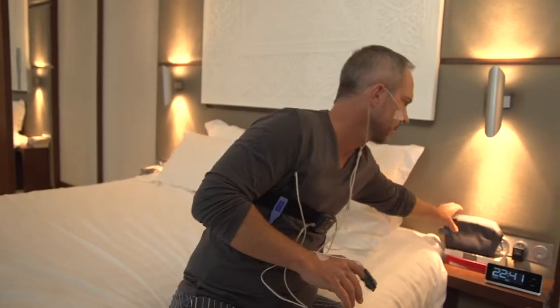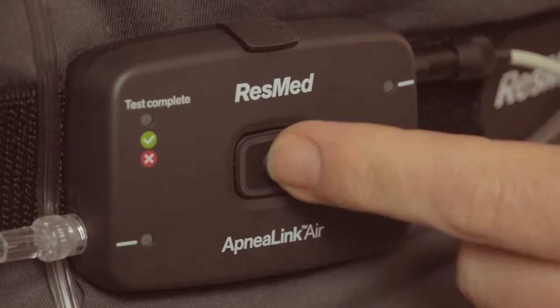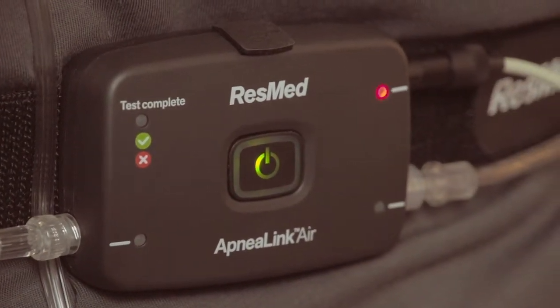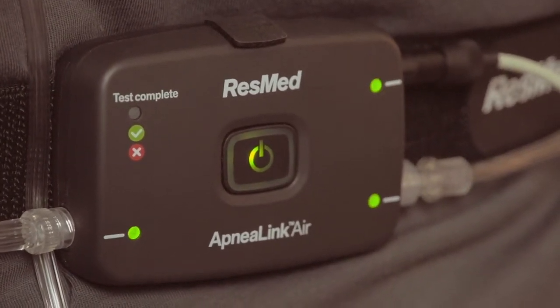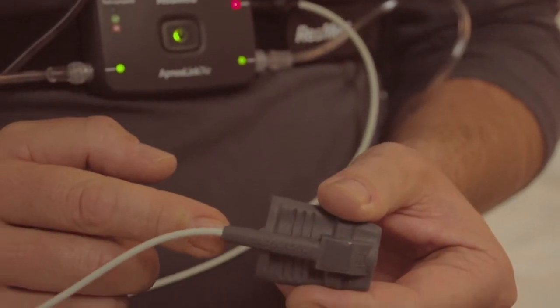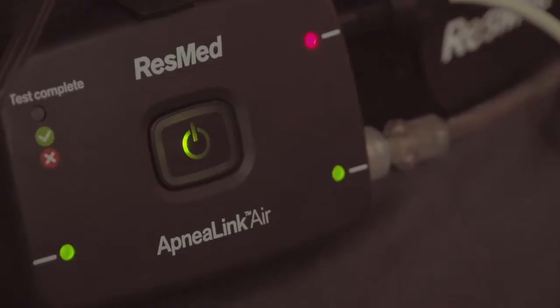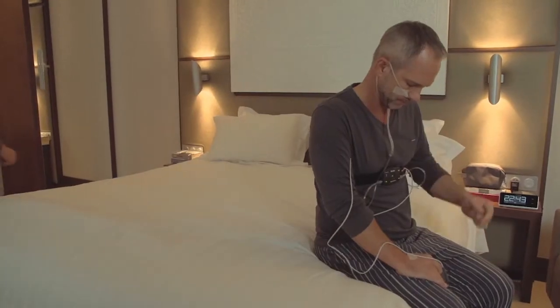The system is now fully assembled and ready to start recording. Start the ApneaLink Air by pressing the on-off button for two seconds. The central green light will illuminate and will dim automatically after 10 minutes. After a few seconds, the small lights on the side will illuminate. If any light blinks red, check that the accessory corresponding with that light is properly placed and connected. Once corrected, it will switch to green after a few seconds. When all lights are green, you can go to sleep as you normally do.